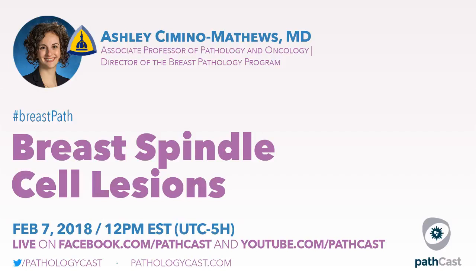Thank you all for joining us this afternoon. It's really a pleasure to present this topic of breast spindle cell lesions. Thank you both, Rifat and Emilio, for the invitation. I love this topic of breast spindle cell lesions, as difficult as it is diagnostically, but because it's so varied, and the differential diagnoses and entities really range depending on whether you have bland spindle cells or markedly pleomorphic spindle cells. So we'll look at a few of the key examples today.